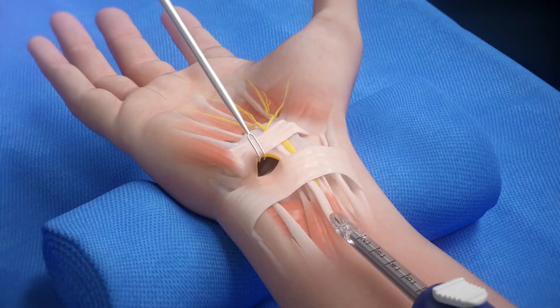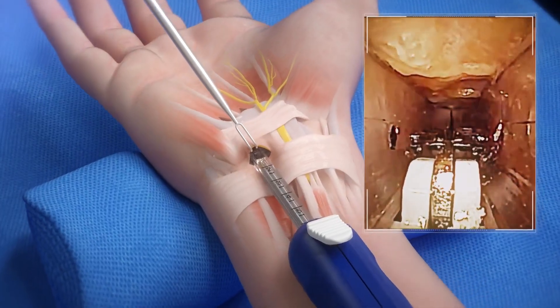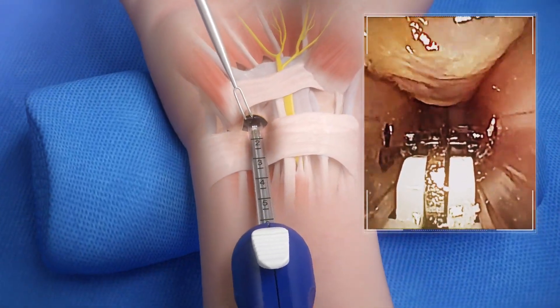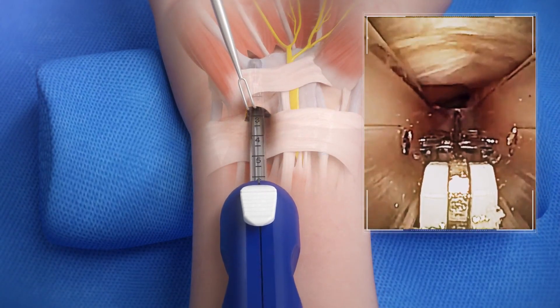Insert the nanoscopic release system into the carpal tunnel space. Visualize the transverse carpal ligament to ensure the device is in the correct plane. Advance the device to the end of the transverse carpal ligament.